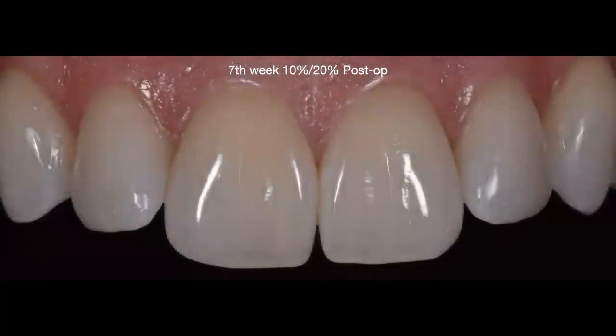So she used, this is 7 weeks later. Again, look at the amount of time that we spent on this case. Some nights she would use only 8 and 9, then she would combine with the other teeth. We had her combining all these treatments, but we always had her use 20%, a higher concentration, on 8 and 9, and you can see how much lighter they became, but you can still see that the gingival aspect and middle third of number 8 is just a little bit darker than everything else.